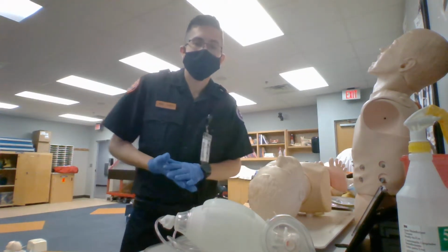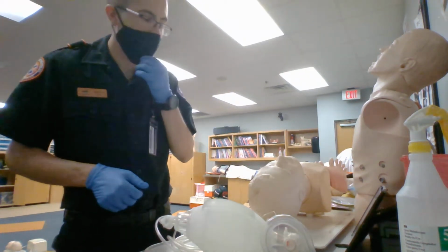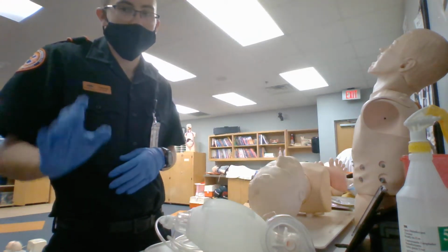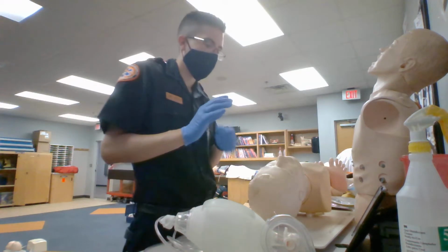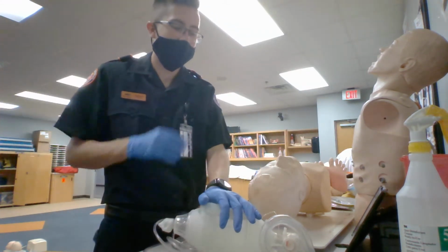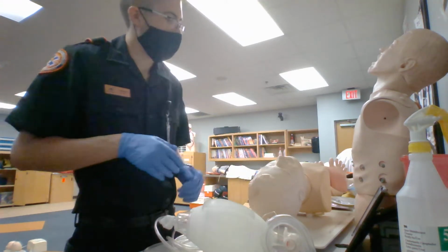Hello, my name is David Trimberger, and this is my second peer-to-peer attempt for nasotracheal intubation. First thing that I want to do is gather up all of my materials, such as capnography, a suction device, an airway adjunct, lubricant, my ET tube, and a BVM with a mask.